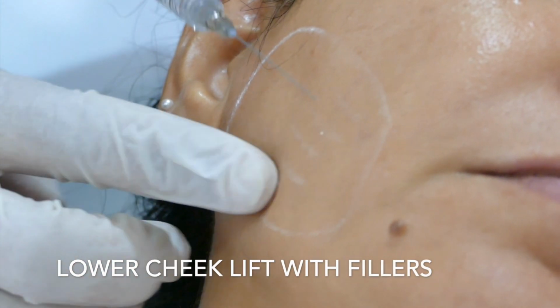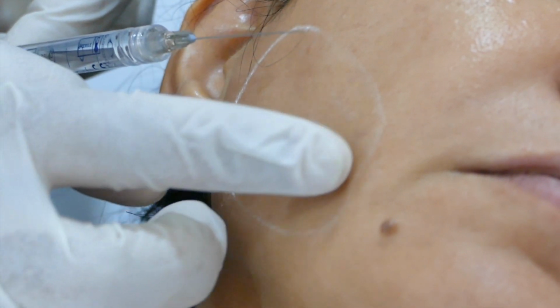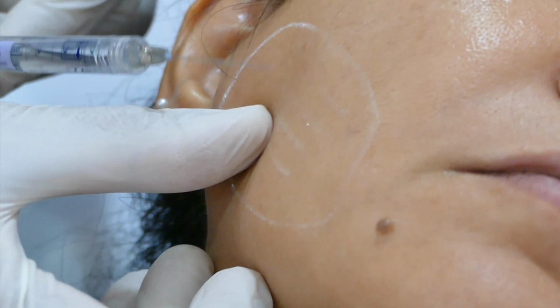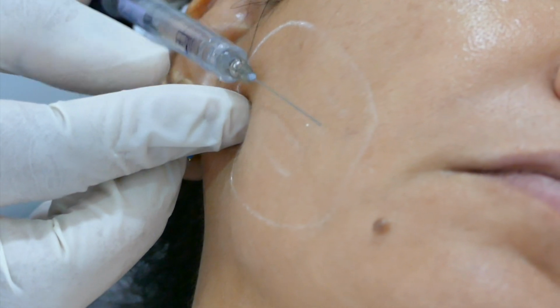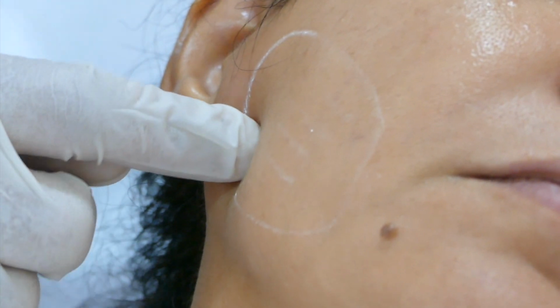So for this procedure, I'm going to use a 27 gauge cannula and inject just subdermis to get some plumpiness on the skin to allow it to lift up. Now where to place the port? So I will check how far I want to reach, and then I will make a decision to make a port in this area here.